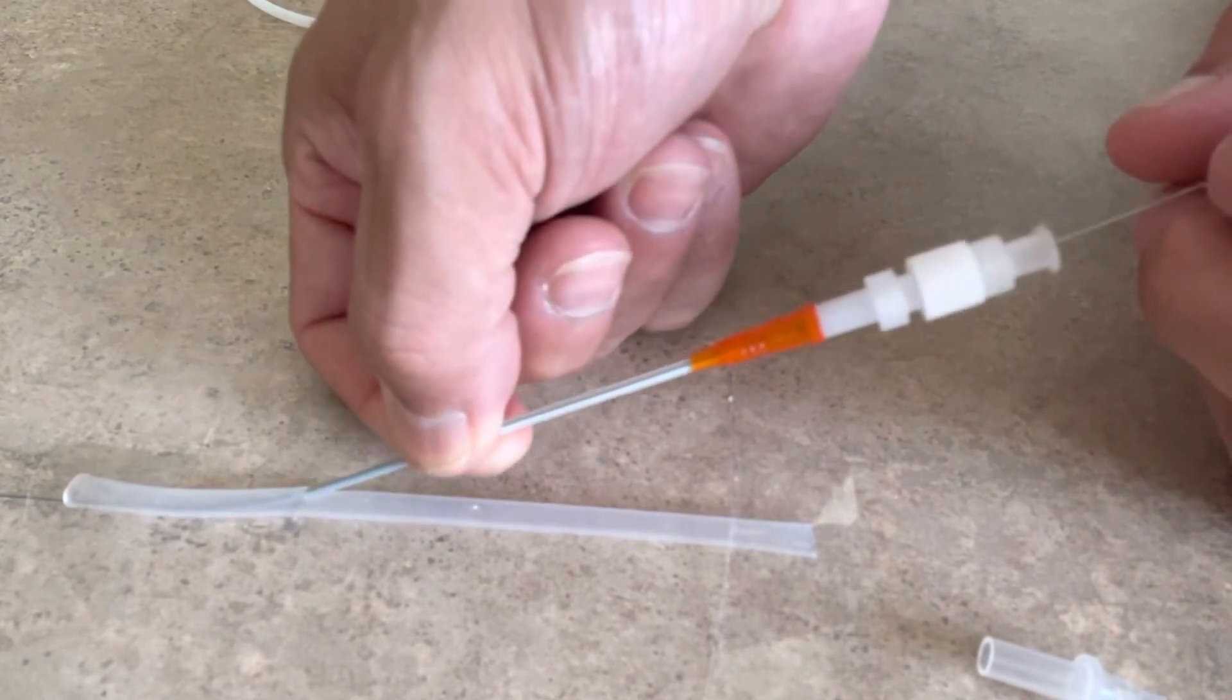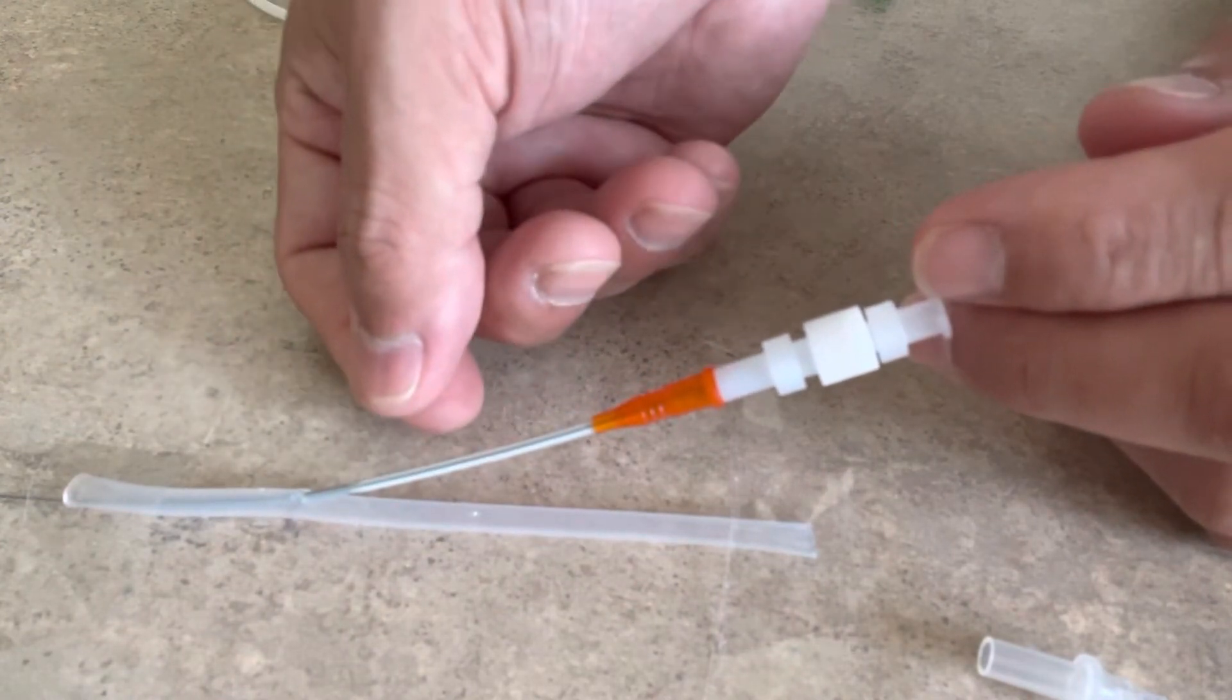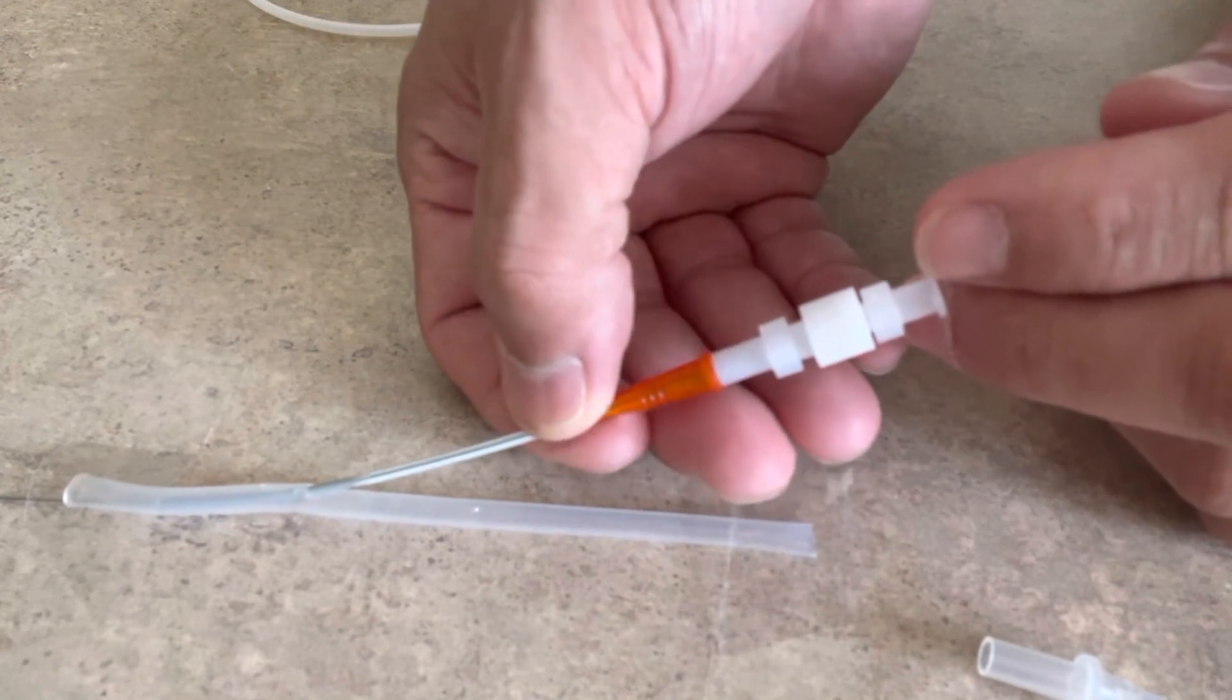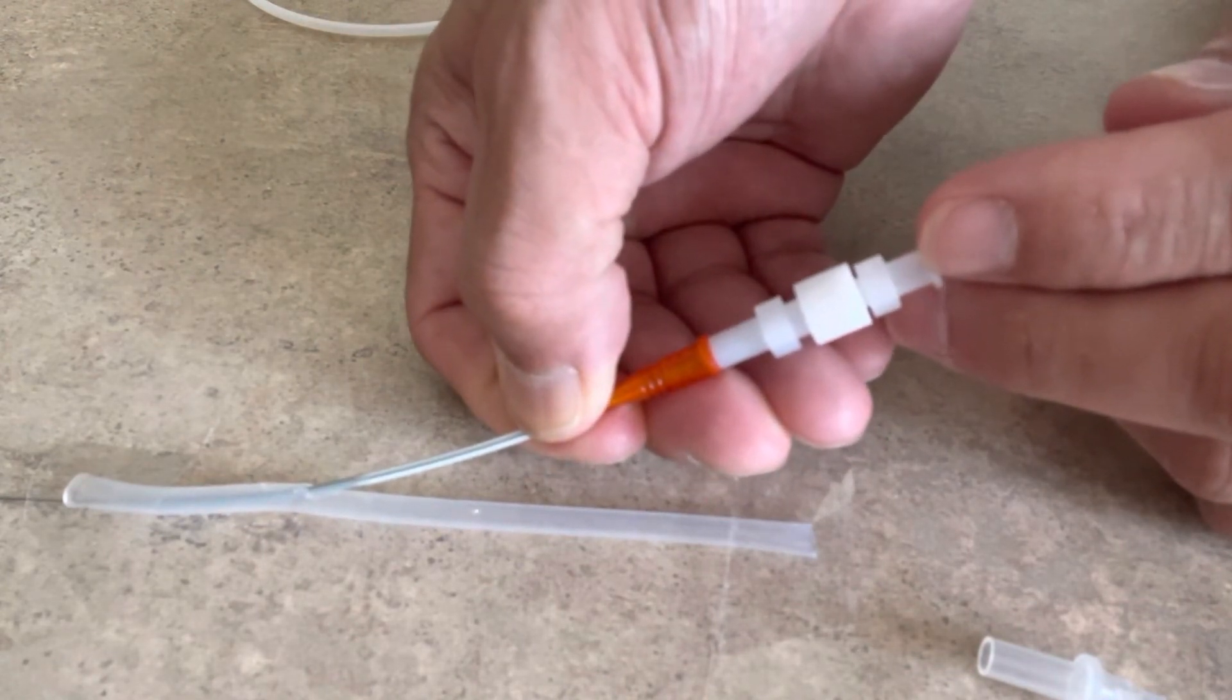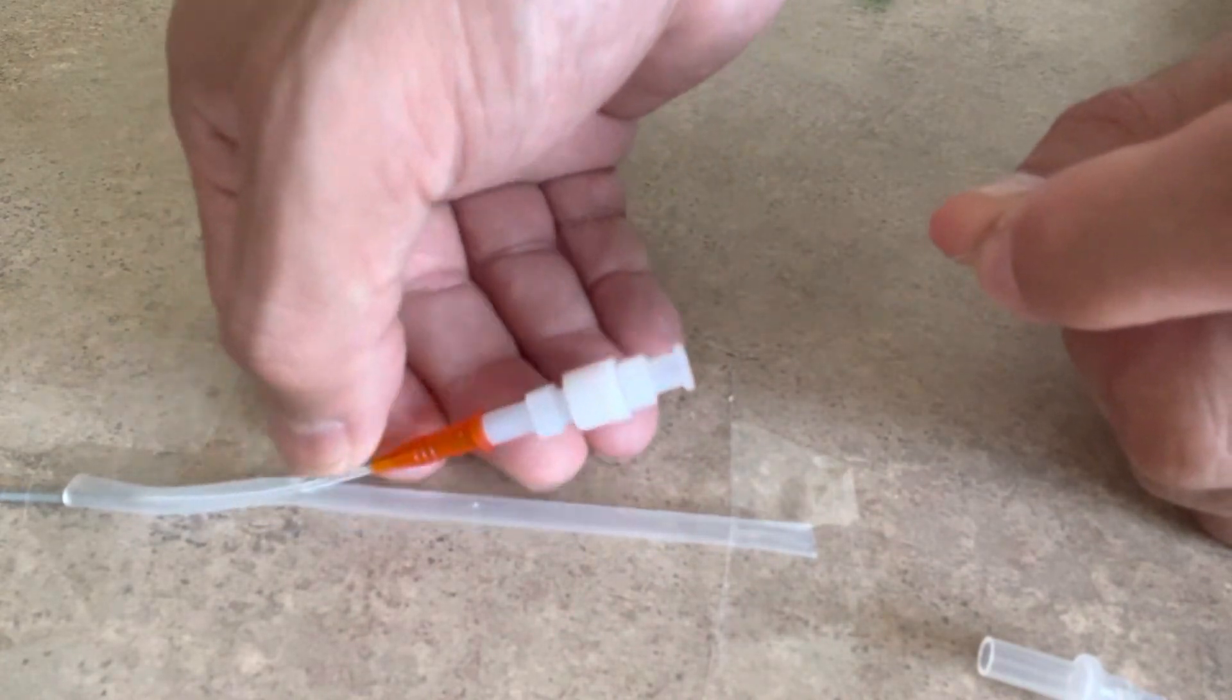And then I'll advance. Once I get a couple of millimeters in, I know I'm pretty good past the skin and maybe into the vessel. I'll back out again and I'll grab up here and I'll do the same thing while I pinch and squeeze as I advance, holding my wire, making sure my wire doesn't go any further.